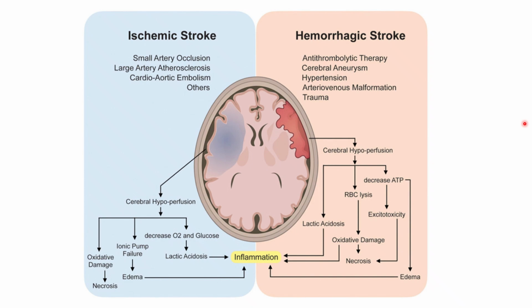One of the things that we can do with FDG is image for stroke. This is not really well accepted. There are a lot of downfalls and pitfalls of it, but it is something that can be done. Still, SPECT is the standard for that. CT and MRI are best for stroke imaging.